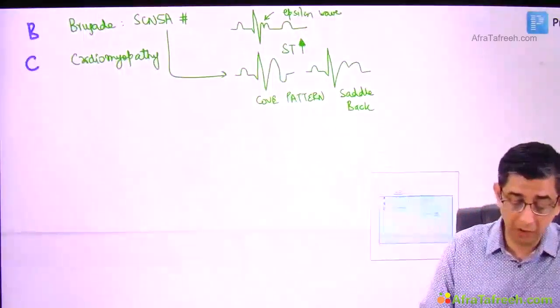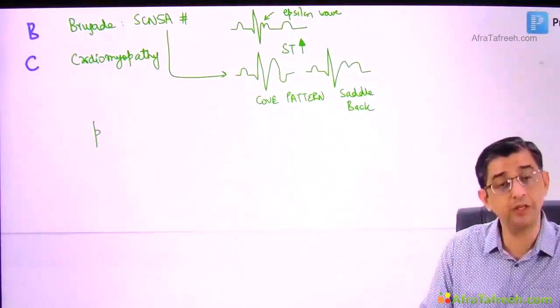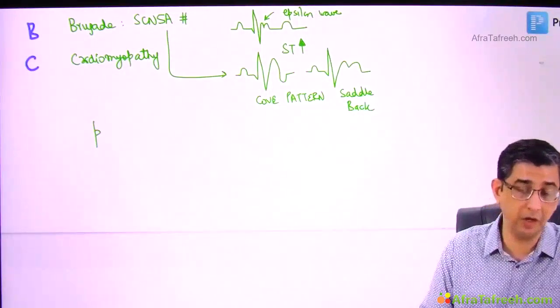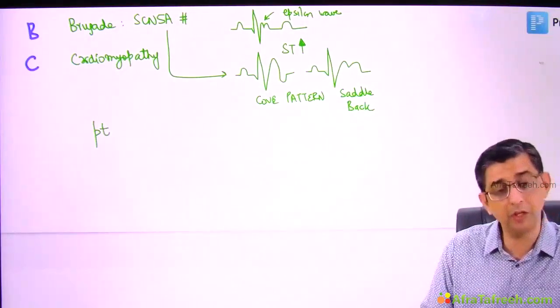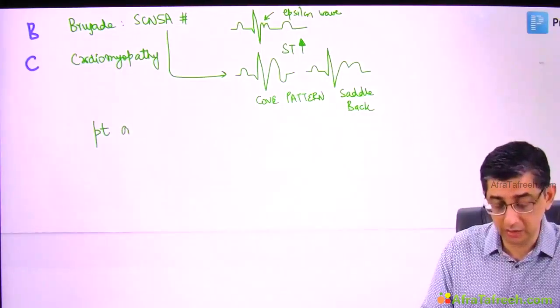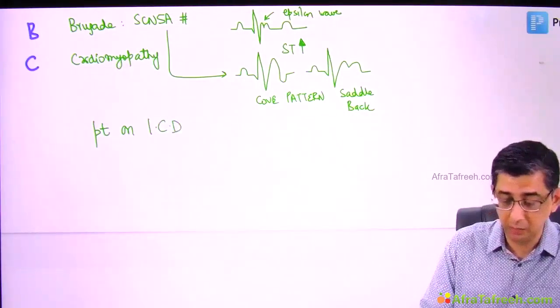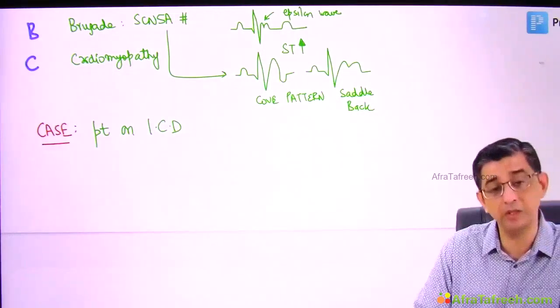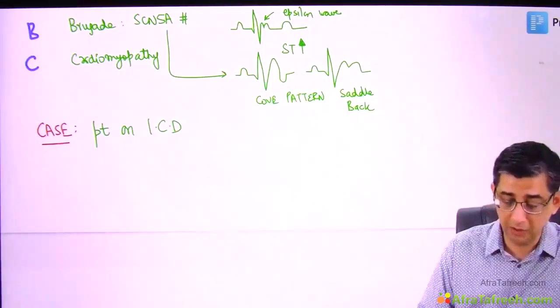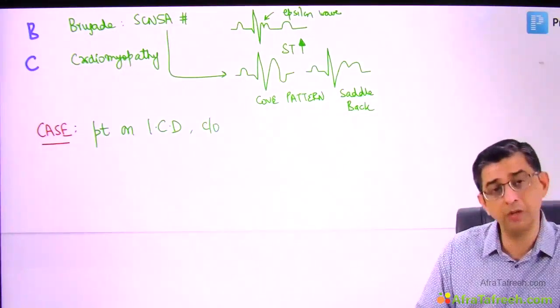I want you to remember that just by looking at the X-ray, we can't say whether it is a pacemaker or an implantable cardioverter defibrillator. But the point is, lots of times they might just simply give you a question which was actually asked like this. He mentioned that the patient is on an implantable cardioverter defibrillator. Now look at the surprising thing that the person is saying. He says, "Doctor, I feel as if electrical shocks are going in my chest."